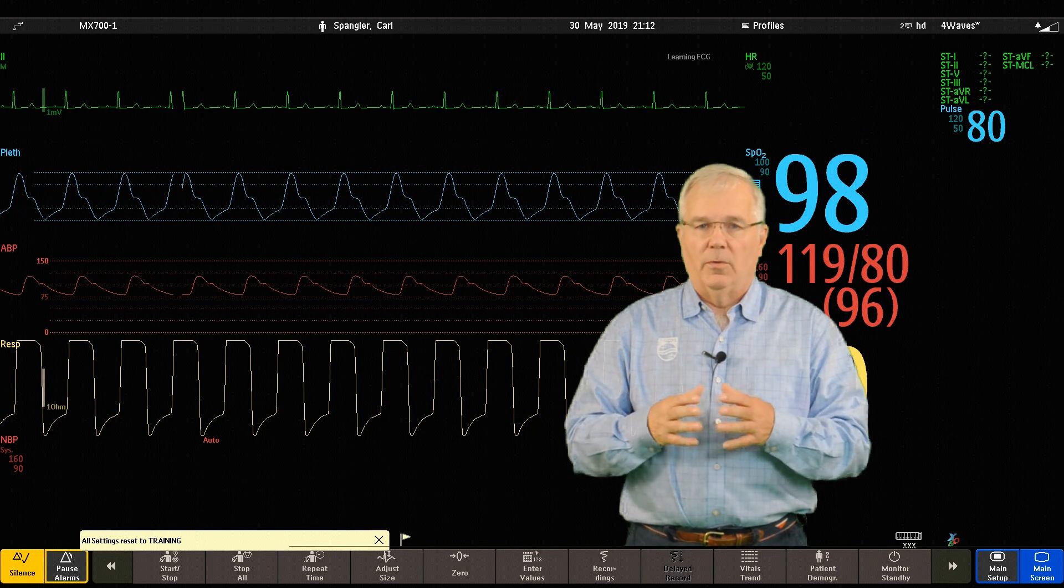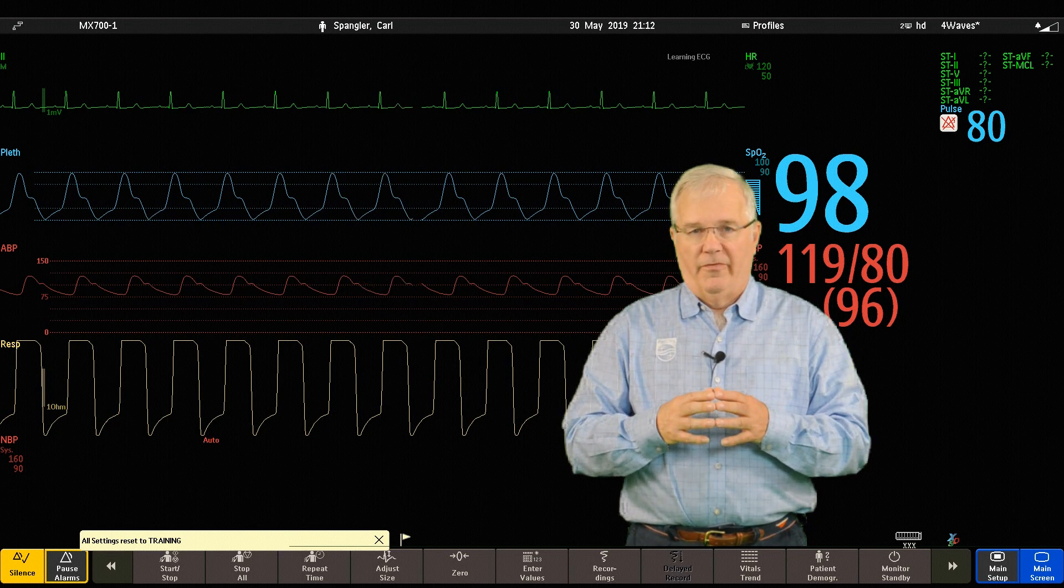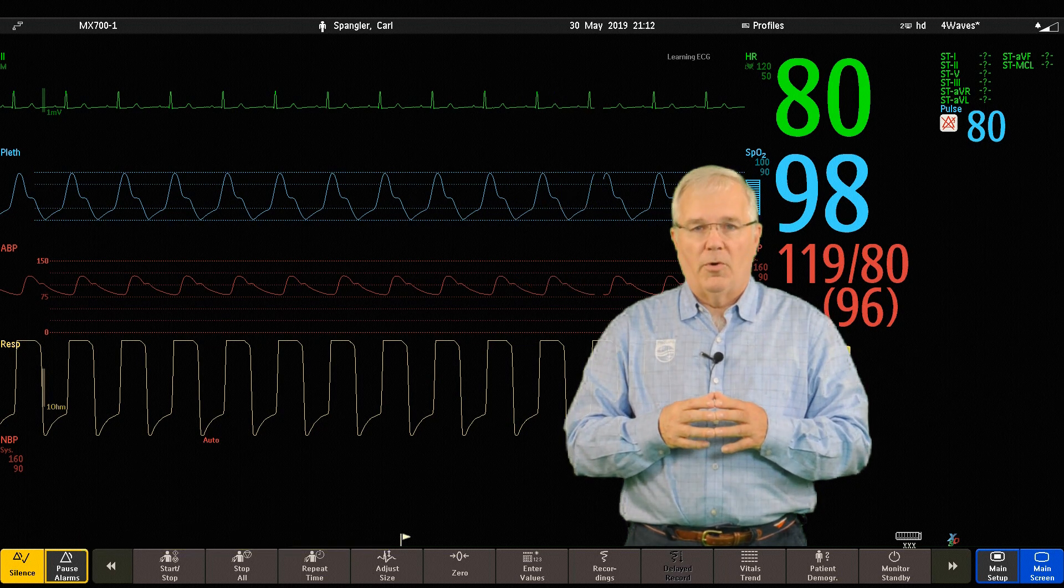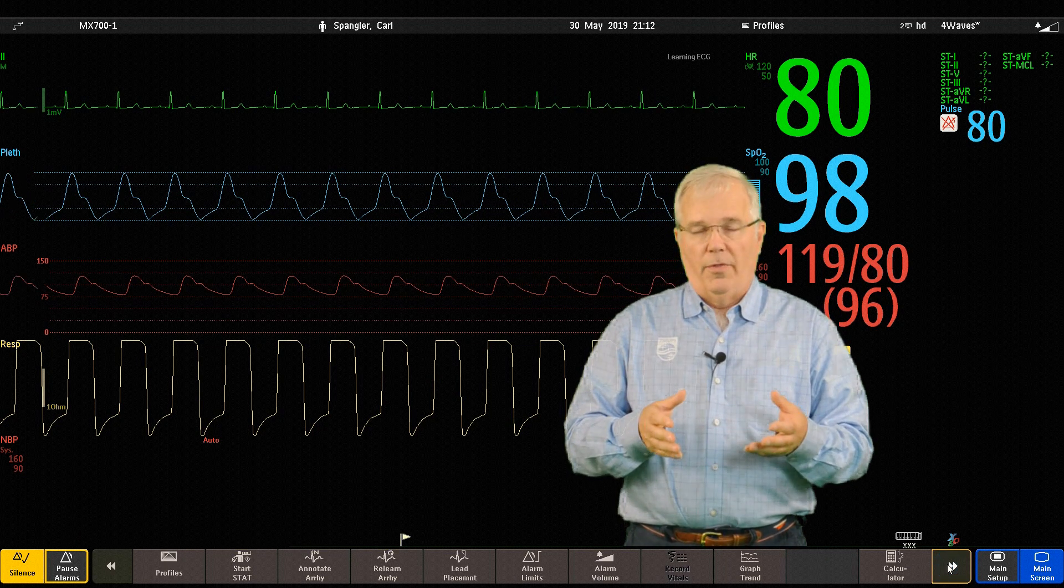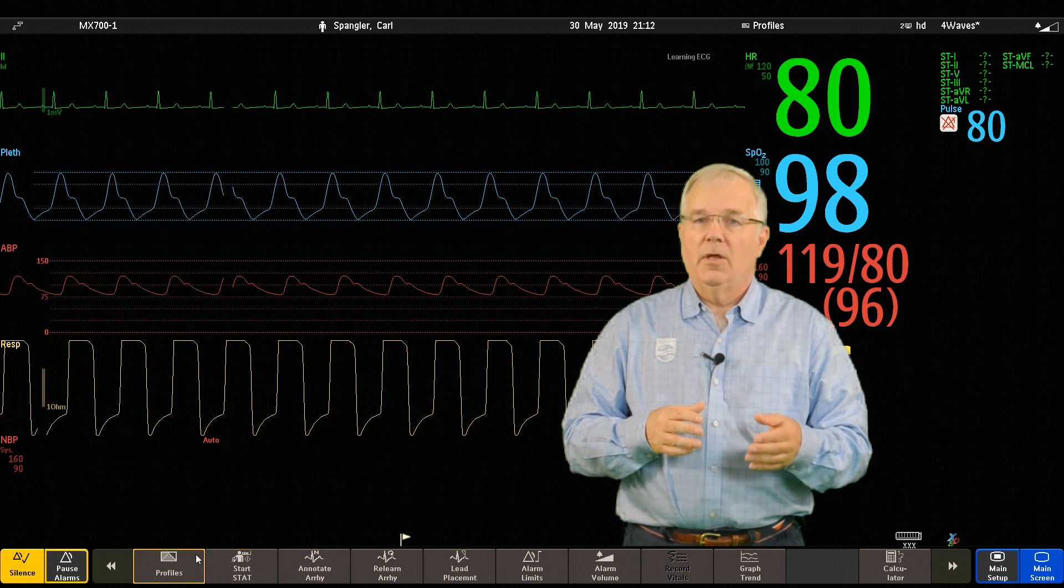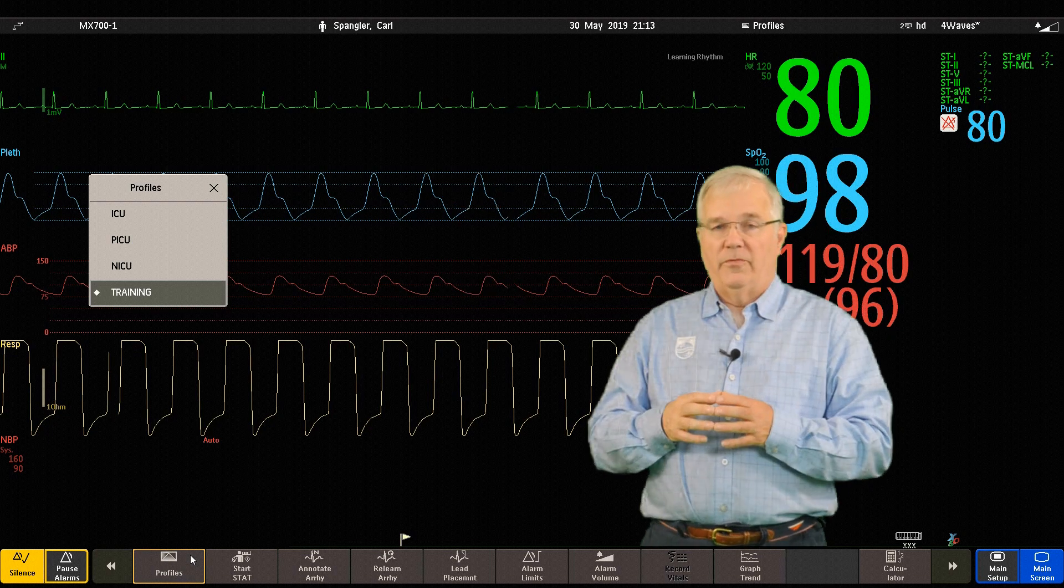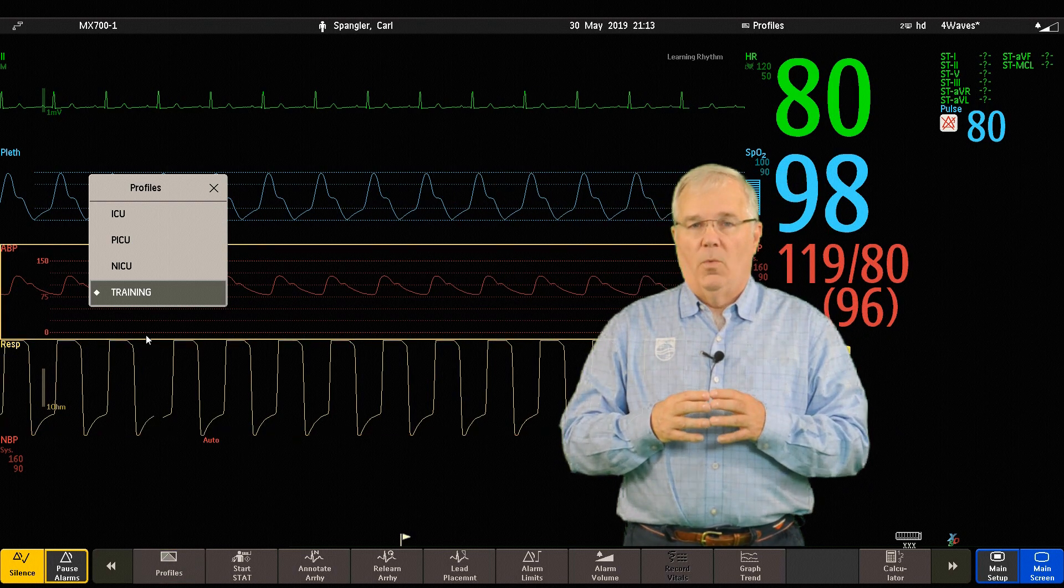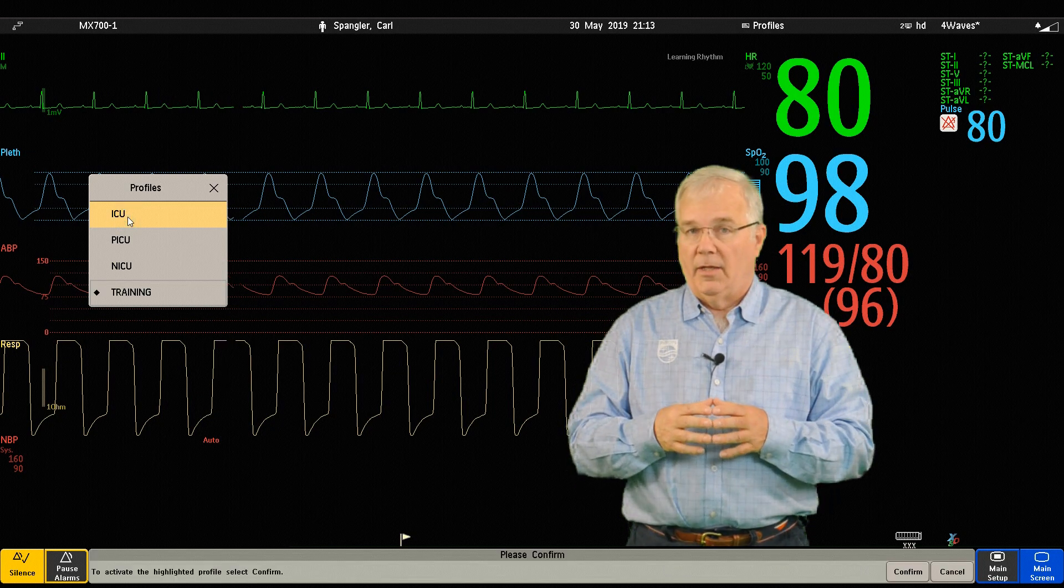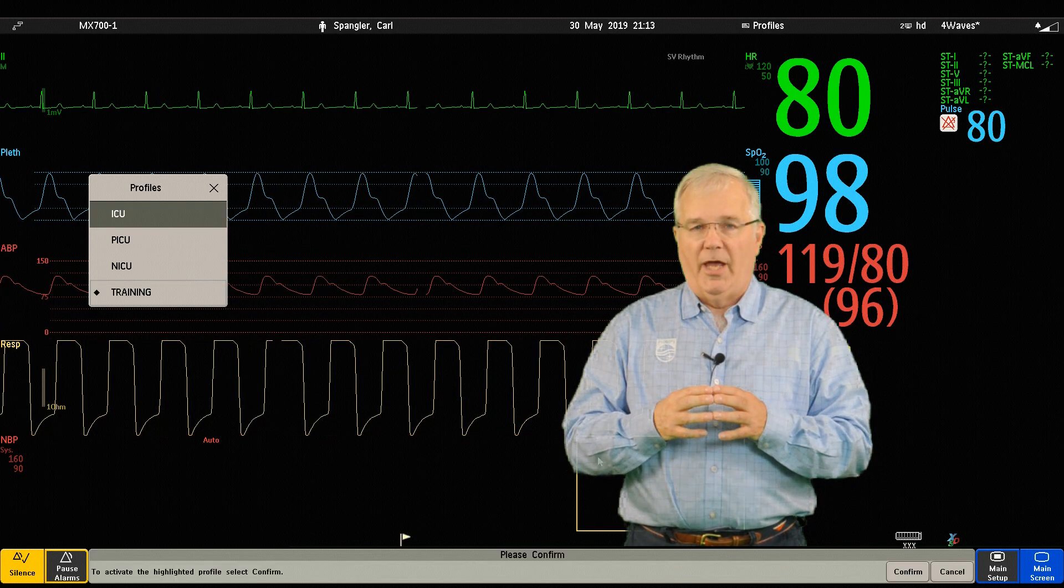The second way to change a profile is by having a smart key configured for profiles. If one is configured, scroll through until you see the smart key for profiles. Touch the profile smart key. That opens the windows for your profile. Select the profile you want. Touch confirm again in the smart key area and your profiles will change.